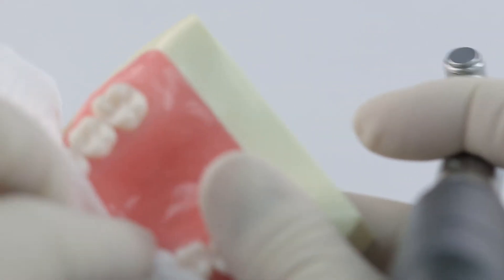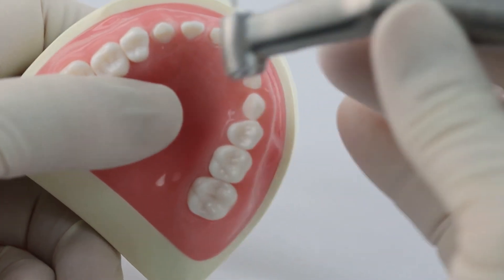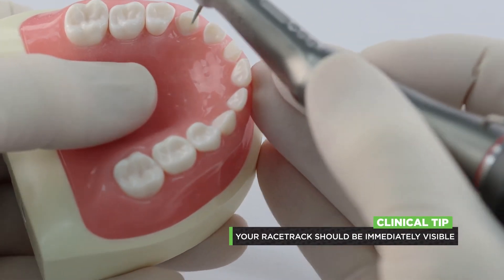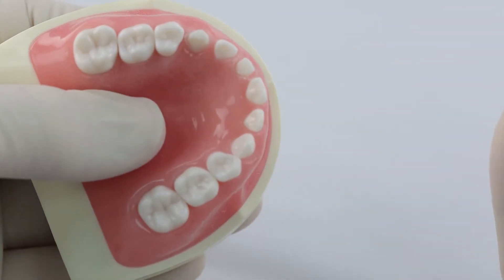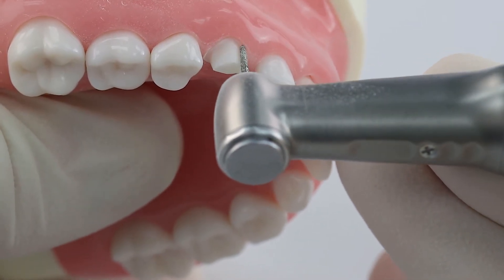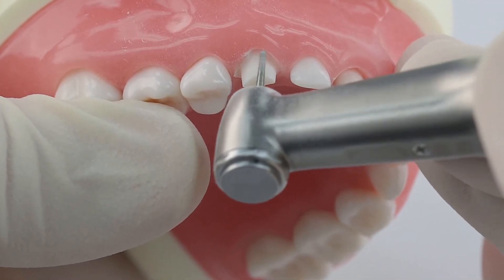Here's something important — a key visual cue when doing zirconia crown preparation: you want to make sure you can quickly identify the racetrack. You should be able to see it in a millisecond. If you have to think about it or can't decide if it's there, it's not enough. Go back and do more so that you can see it all the way around the tooth immediately. It starts to get faint right here on the straight buccal, so I'm going to go back and prep a little bit more so I can clearly see that racetrack all the way around.